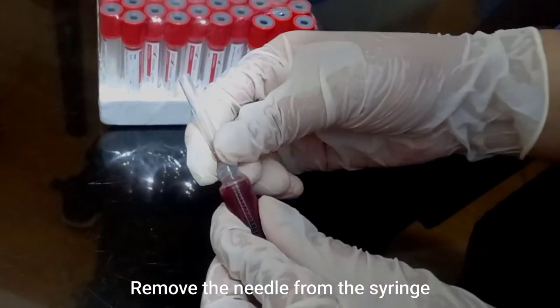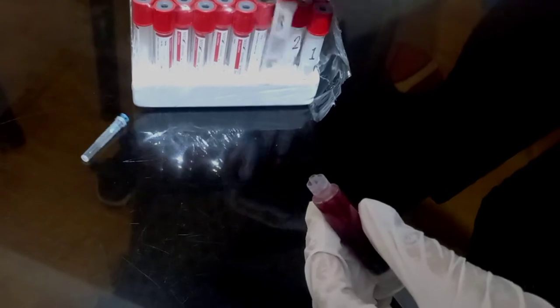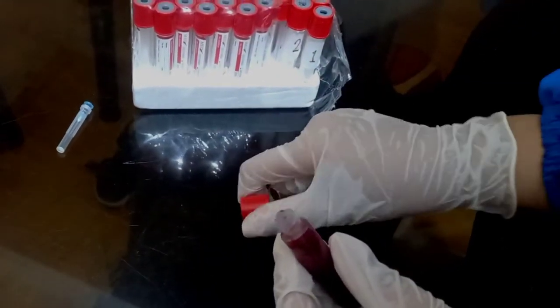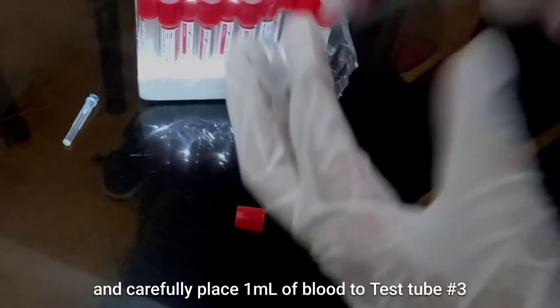When we remove the needle, carefully place 1 ml of blood into test tube number 3.